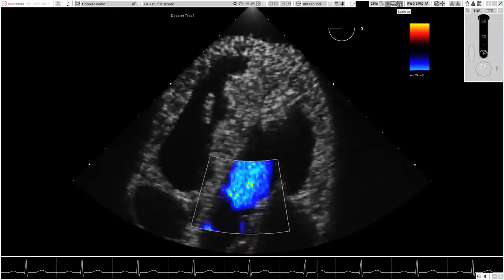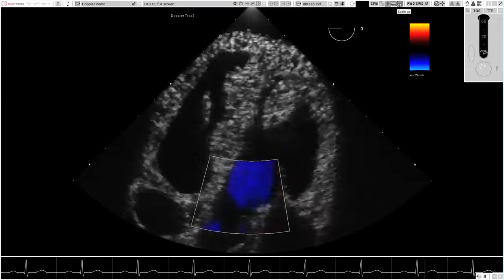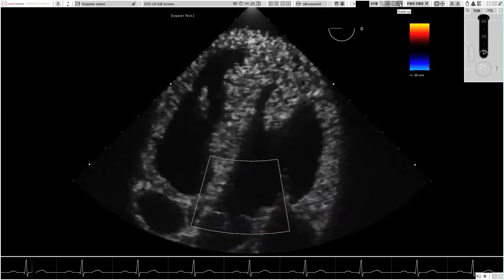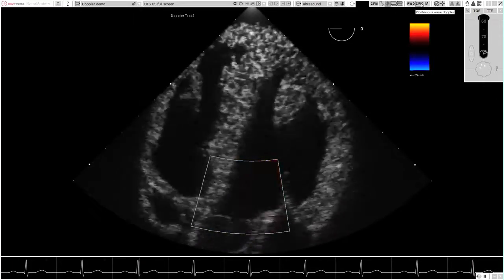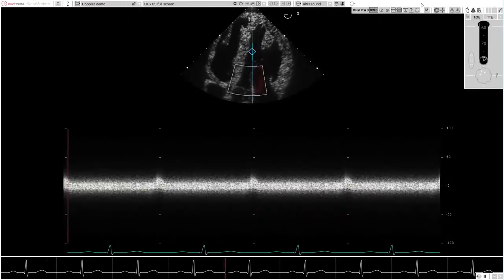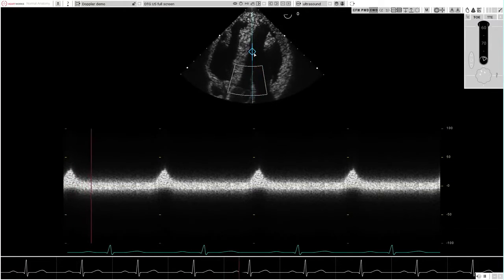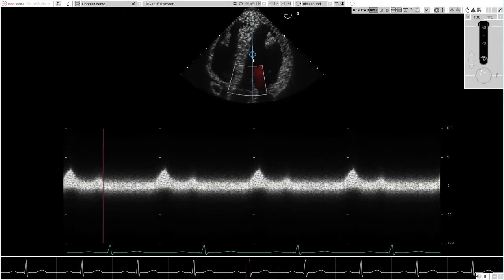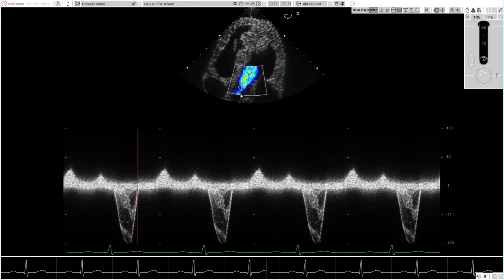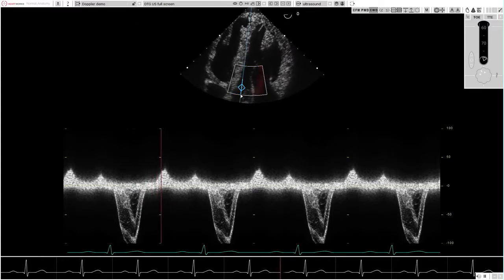Changing the color flow mapping velocity scale is seen accurately to change the pattern of aliasing. Continuous wave Doppler imaging is associated with the same range of features as pulsed-wave Doppler, with an appropriately extended velocity range.